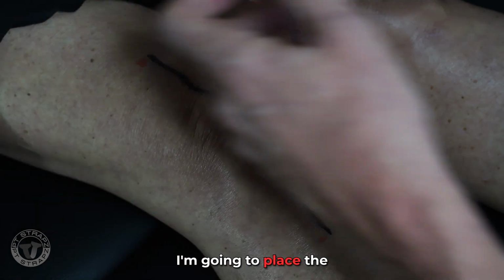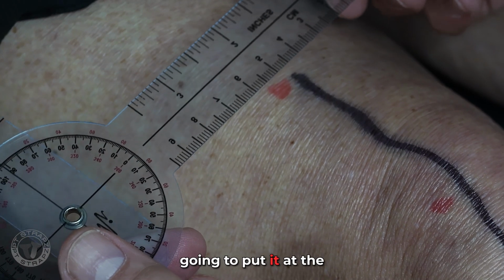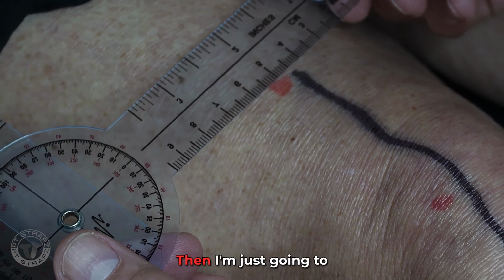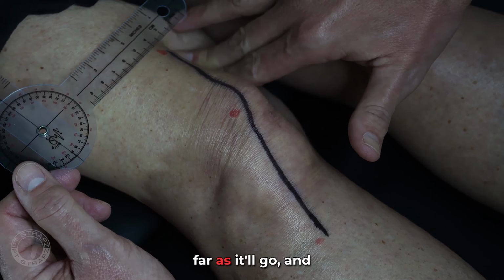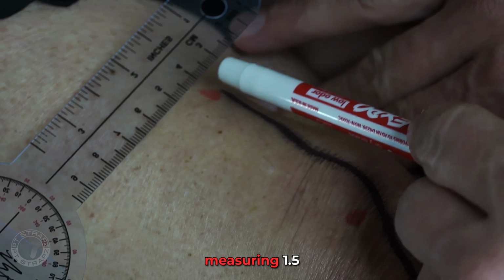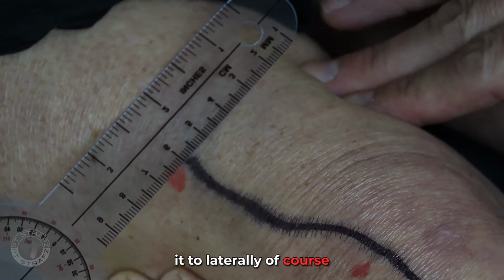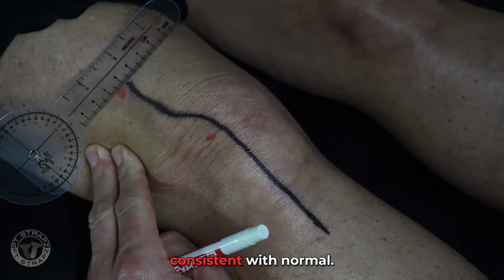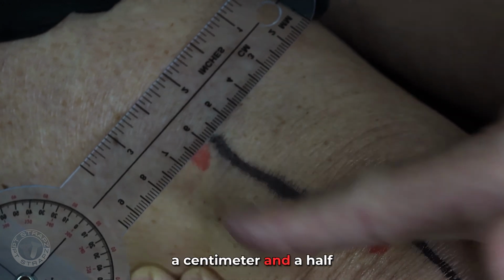I'm going to place the goniometer. Where the top red spot is, I'm going to put it at the 5 centimeter mark, and that's going to be my mark. Then I'm just going to physically pull the skin medially as far as it'll go, and I can measure where that point actually goes, measuring 1.5 centimeters. Then I pull it laterally, and of course, she doesn't have any scars, so we're getting numbers that are more consistent with normal. So that measures, starting from the 5, 1.5 centimeters laterally.